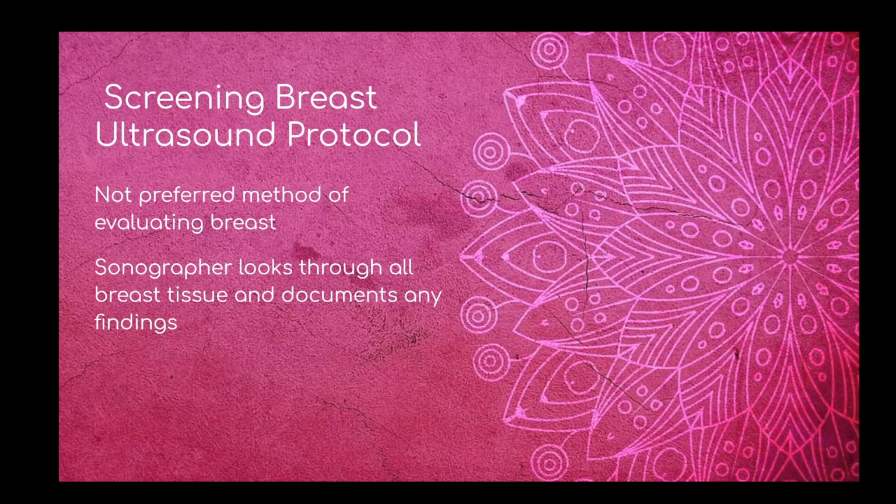So when we do screening breast ultrasound, it is up to you as the sonographer to sweep the entire breast looking for any abnormalities. And as you get a chance to practice some breasts or watch some more breast videos, you'll see that there are little shadows and inconsistencies that are going to catch your eye all over the place. It is very difficult to pinpoint, especially a very, very tiny starting cancer. So screening breast ultrasound is not the best method, almost solely because it's so user dependent, and that puts a lot of pressure on you and the radiologist.